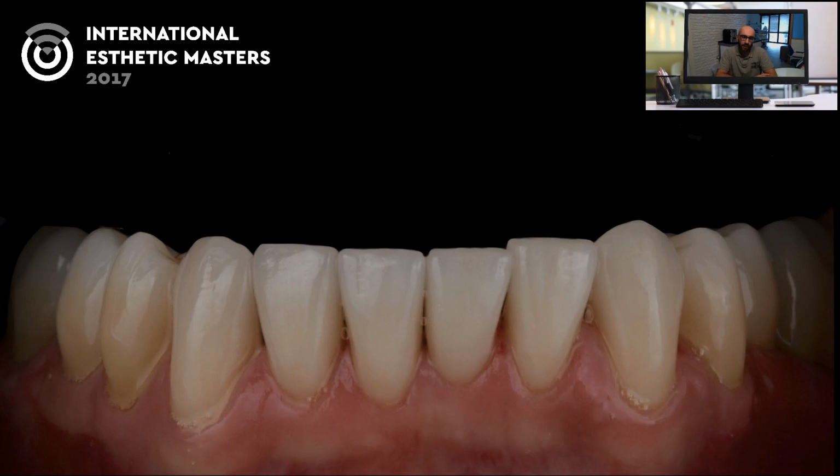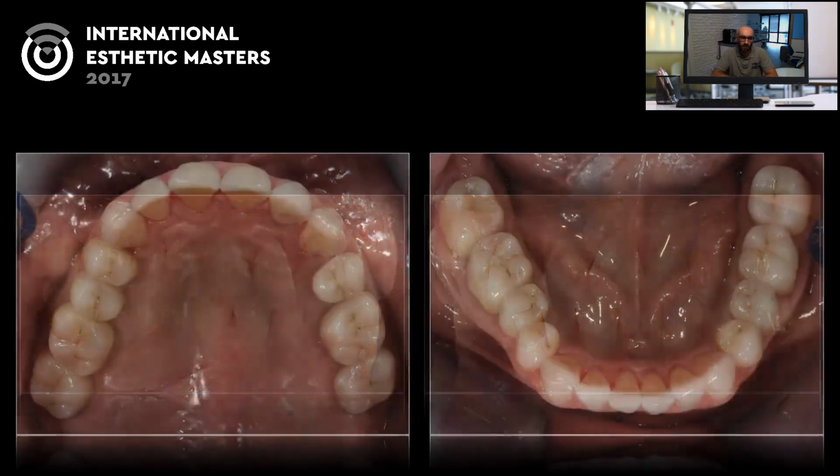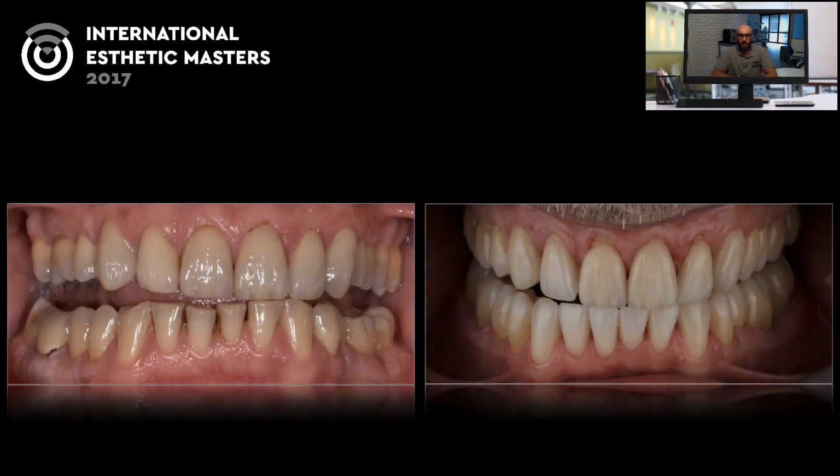These are the 6 lower veneers, and you can see there is no big difference between these veneers and the posterior full monolithic. You start on the premolar with full monolithic zirconia. You can see here the posterior made with zirconia. The 6 upper anterior, I think, were veneers made with feldspar, but I'm not sure. Tooth 1, 2 is our crown, and also the 6 lower veneers were made in feldspar. Here is the result, full mouth restoration. As you can see here, I think it's a very good integration, the comparison before restoration and then after restoration.